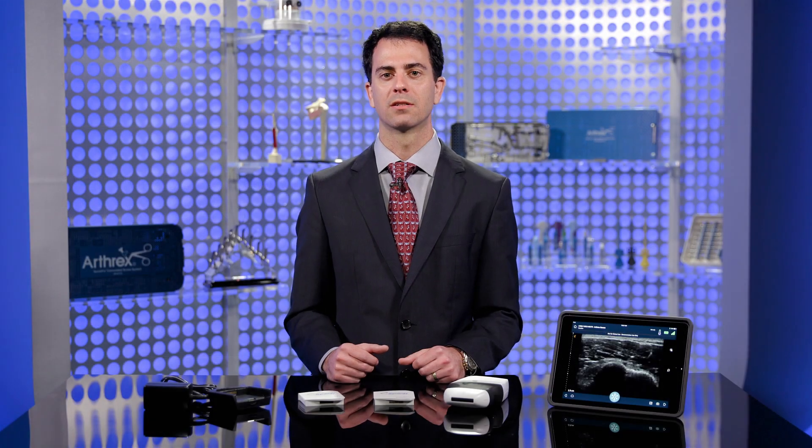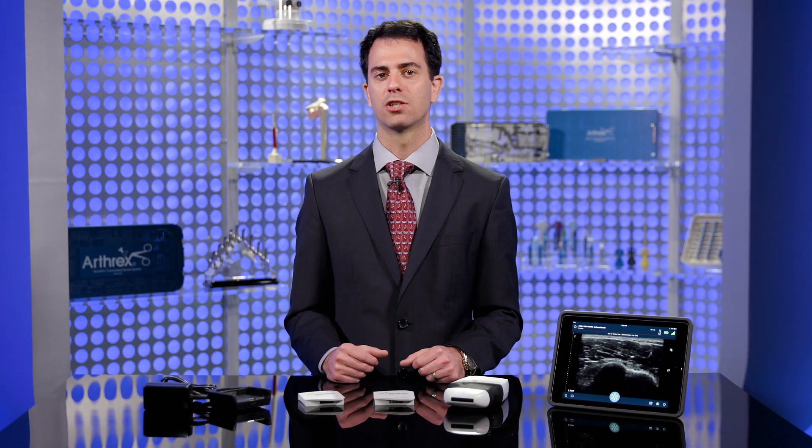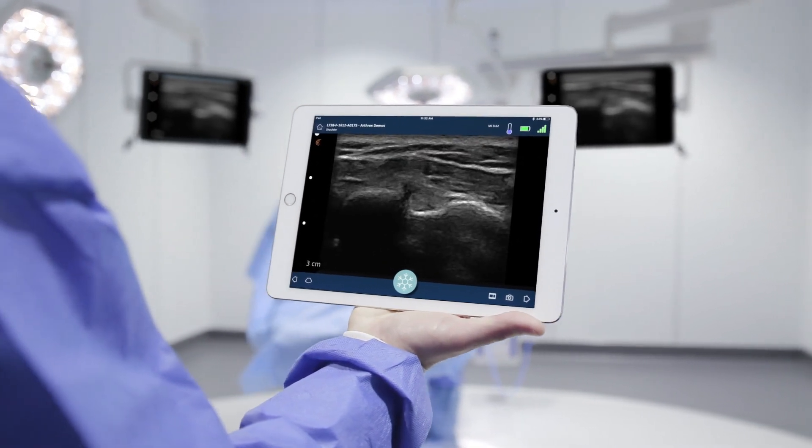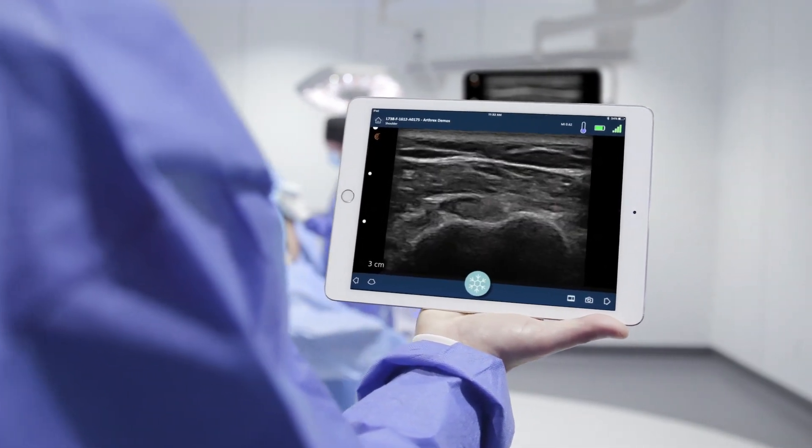Arthrex is glad to present the first-of-its-kind Synergy MSK Ultrasound, a high-resolution wireless handheld ultrasound scanner that seamlessly transmits real-time images to an iOS or Android mobile device.